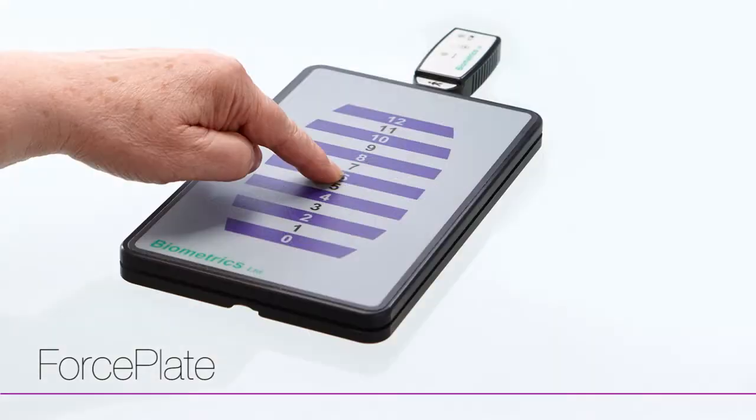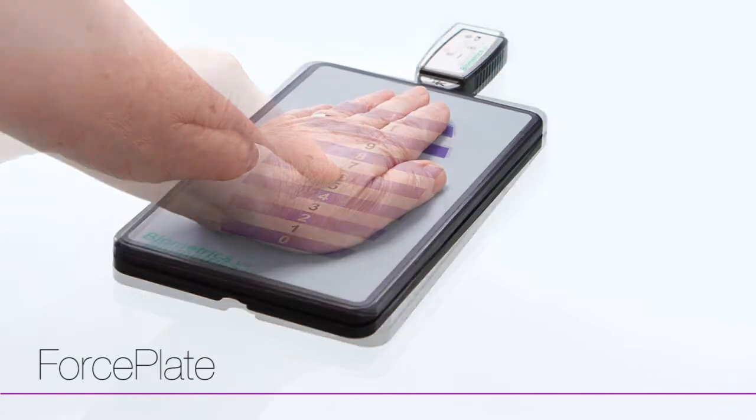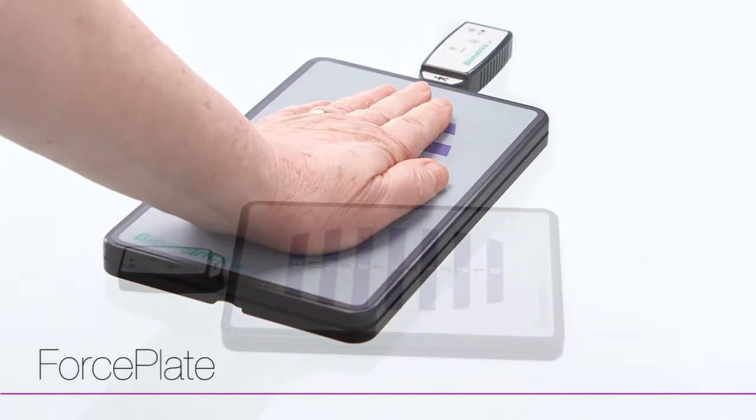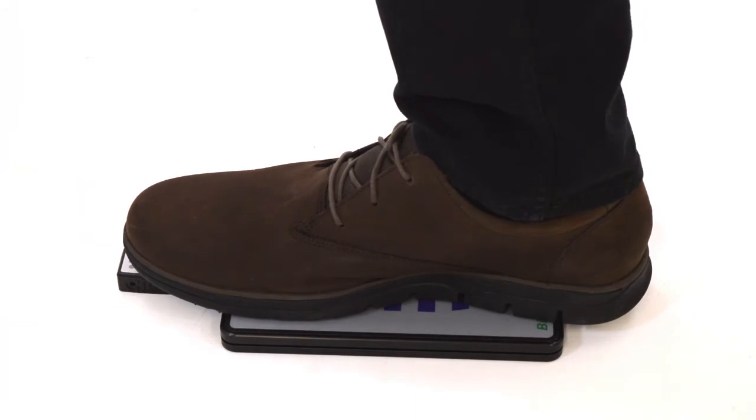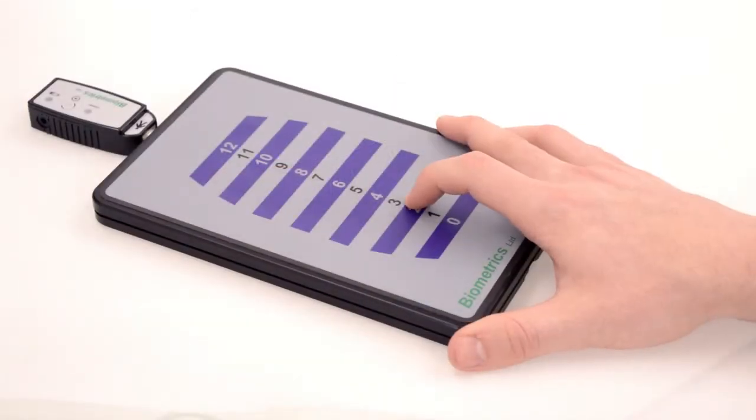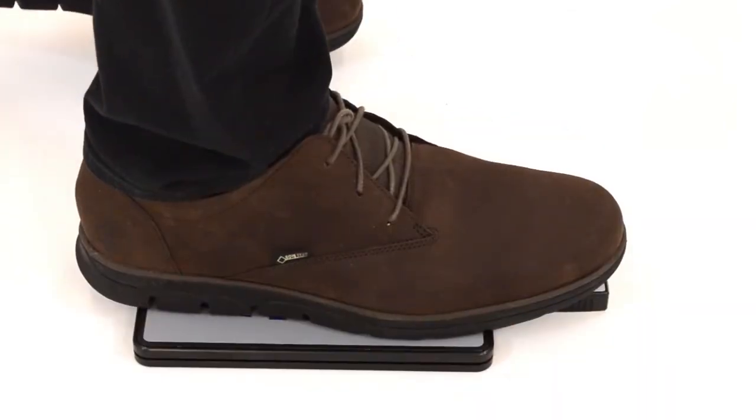The e-link force plate registers weight as little as 0.1 to 100 kilos or 0.1 to 220 pounds. It is perfectly designed for both upper and lower extremity weight bearing exercise, accepting the light touch of one finger through to full weight bearing on one limb.